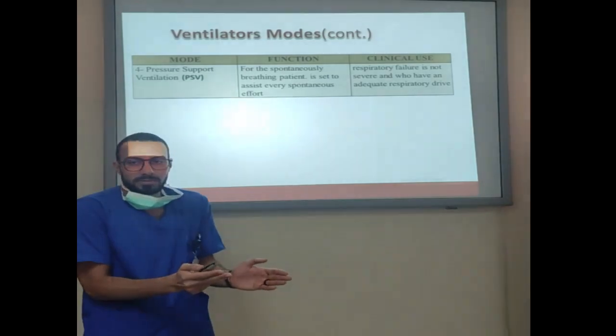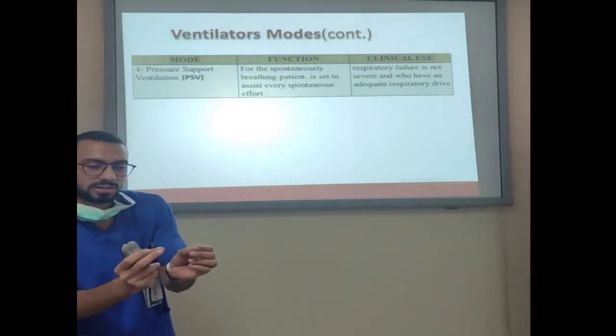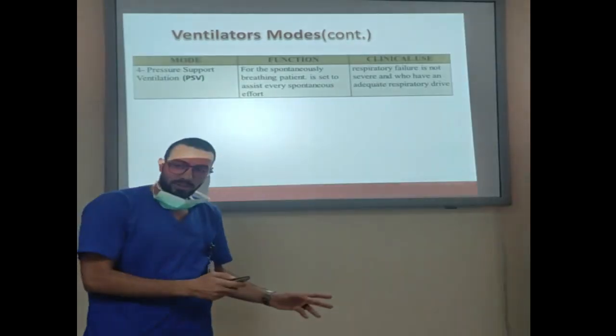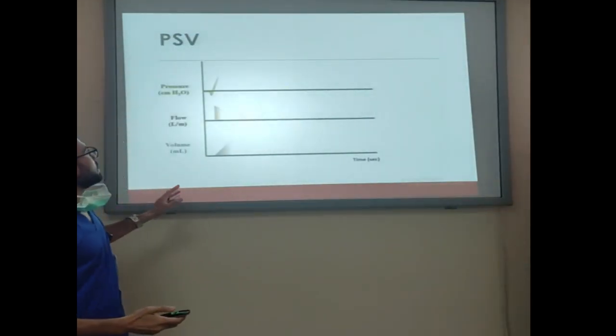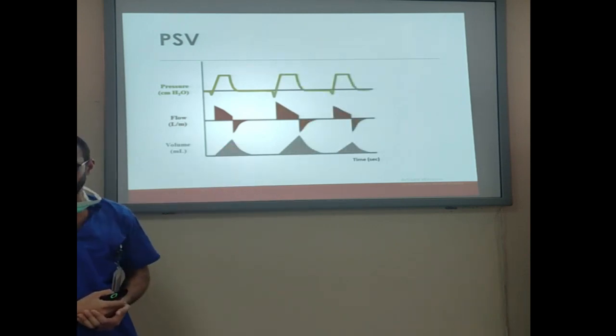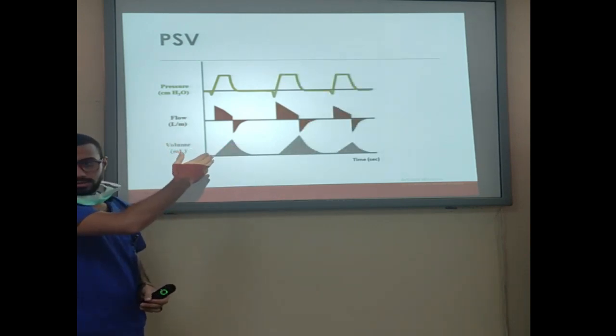I will let the patient try himself. I will just reach the target of pressure. This is the issue. But I will not give unless the patient takes a breath. Let us see the PSV here. This is the shape of the ventilator. You will see this kind.